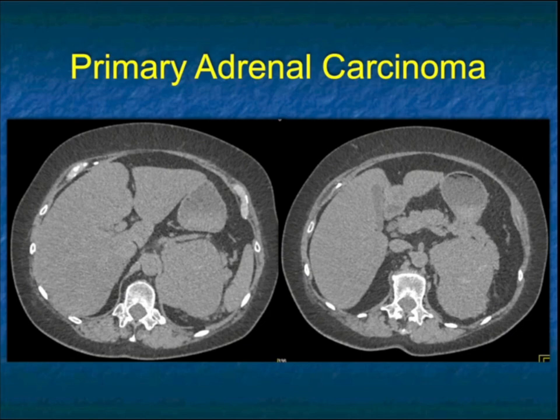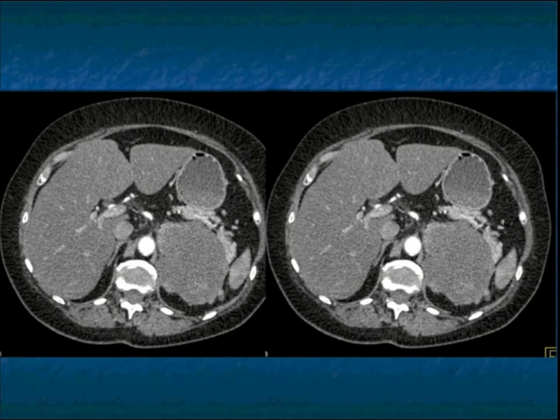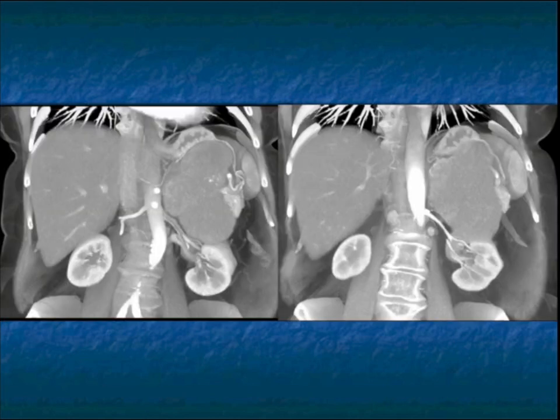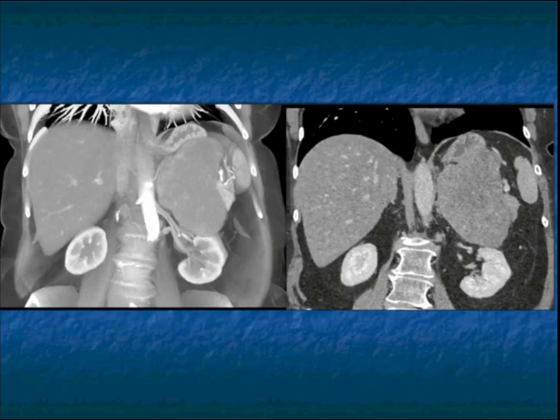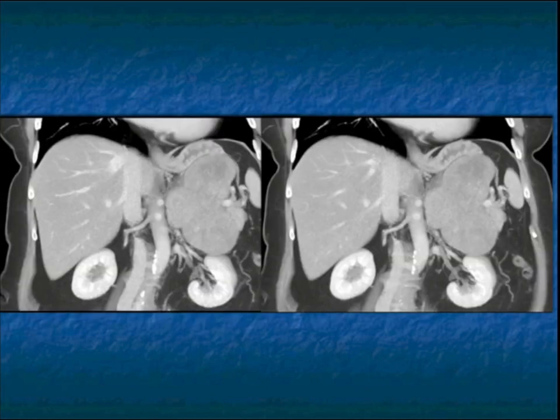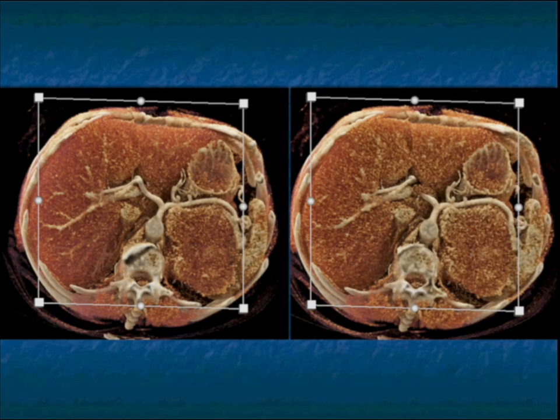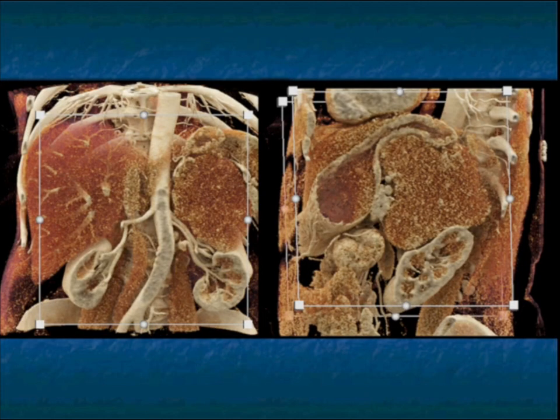Another example, non-contrast CT. You can see that not every adrenal lesion enhances to any degree. Large mass, there's minimal enhancement on this very large tumor, but based on size, you have to worry about malignancy. As you go from arterial to venous, perhaps there's a little bit better enhancement, but you can see there's not great enhancement. Again, a large mass, lobular, irregular margins, you've got to be thinking ACC. You don't necessarily need to see a vascular lesion, and this case I thought was a good example of showing you that. And here's the texture mapping with cinematic rendering, and I think that's very nicely shown in this example.